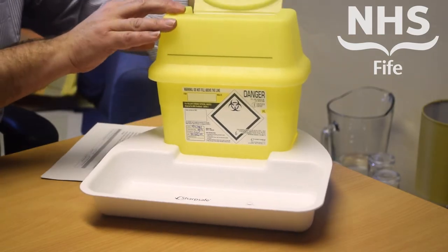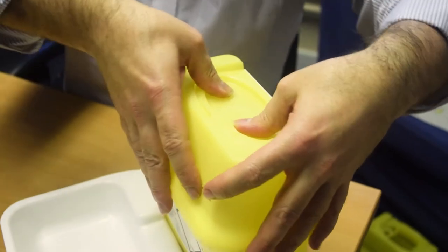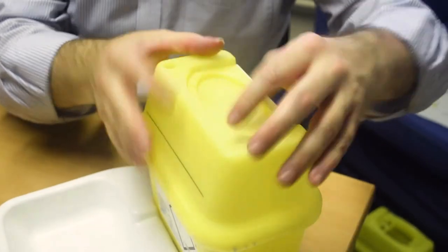Key points with the sharps bins are the fill line. Sharps bins must not be filled beyond that line. When it is full, make sure that the final closure is put in place by pushing the lid securely down until it locks into place.